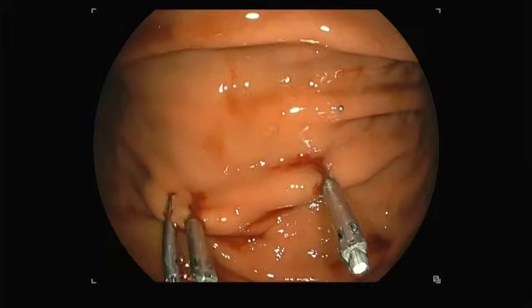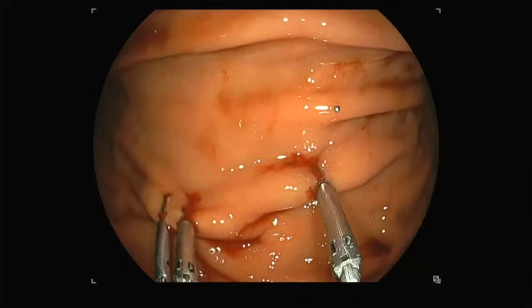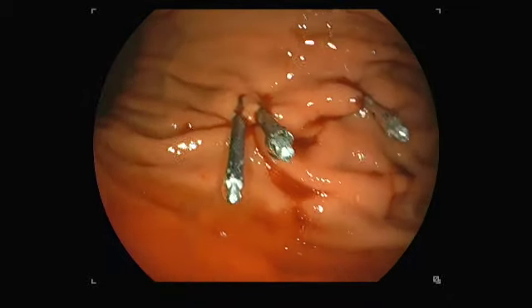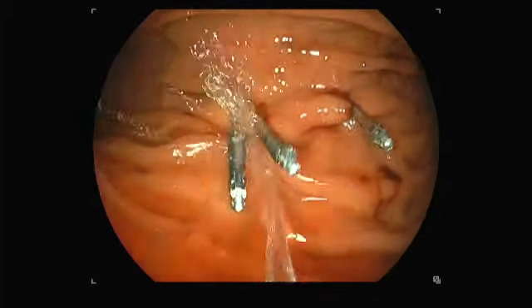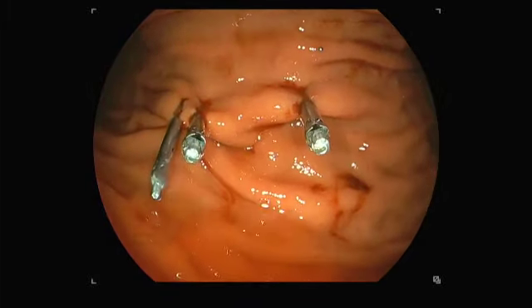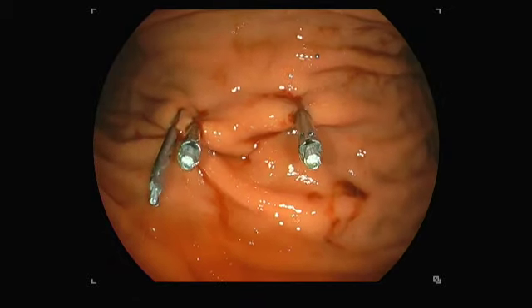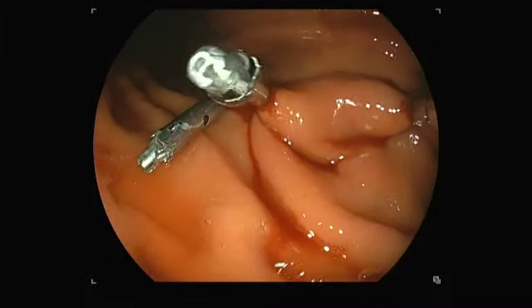Now that the bleeding has stopped, we wait to assure ourselves that we have achieved complete hemostasis. So it is important to wait. There is a little bit of a trickle of blood that you could see now, a little bit coming, much better than before, but you want to control that bleeding also.